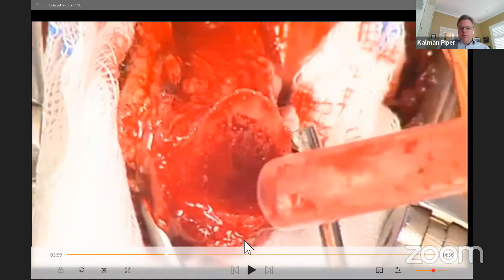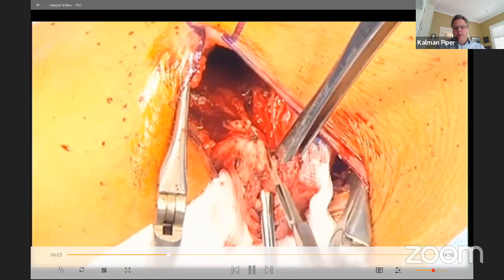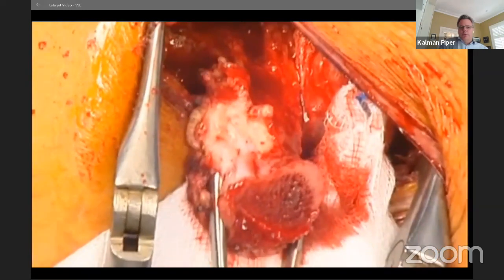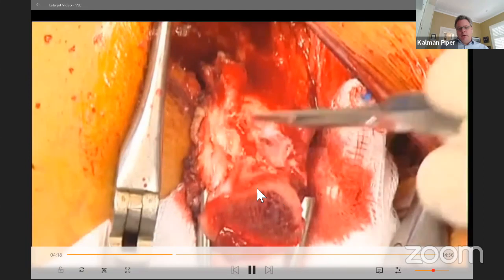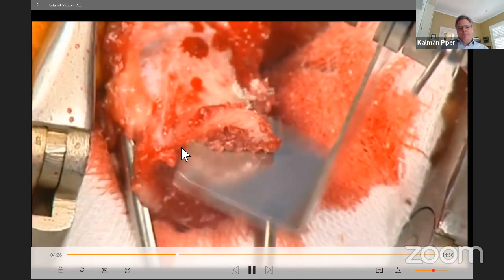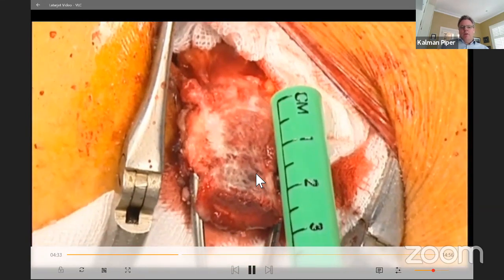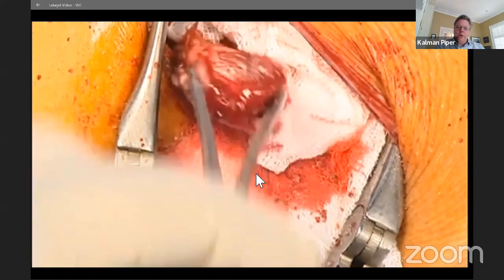So the subtle difference is that with the French technique, the screws would be traversing the coracoid in this direction, the American technique in this direction. This is obviously the French technique, the way I was trained. The undersurface is cleared of soft tissue, and then the right angle blade saw is used to remove that little elbow of bone that remains attached to the coracoid graft and create a nice big surface area. So you can see here, you can use the right angle blade or a 4mm burr. But once the preparation of the graft is finished, you've got a beautiful big surface area on the undersurface of the graft to heal against the glenoid neck. And that's been the way I've been doing it since my training in France.